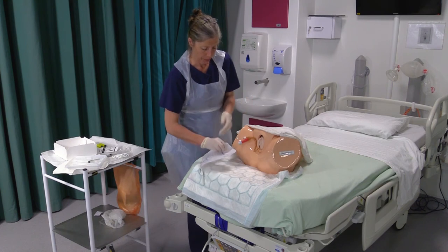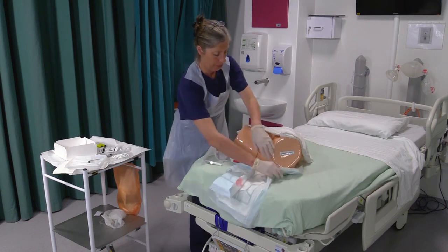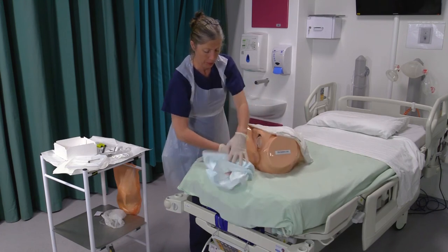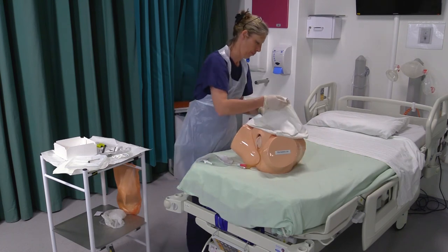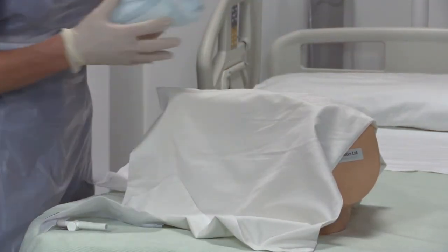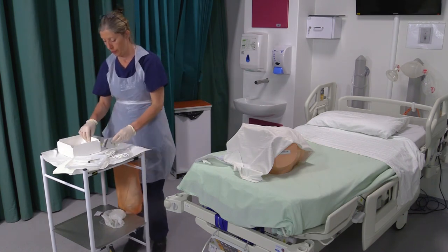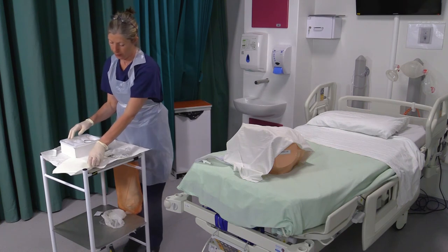Plan the care of the catheter with the patient and note this in the care plan. Include the date of changing and removing the catheter. Make sure you document in the patient's notes record and date the type and the size of catheter, the amount of water in the balloon. Most catheter packaging comes with a sticky label bearing the necessary information. Note the amount of urine that is draining and the rate.